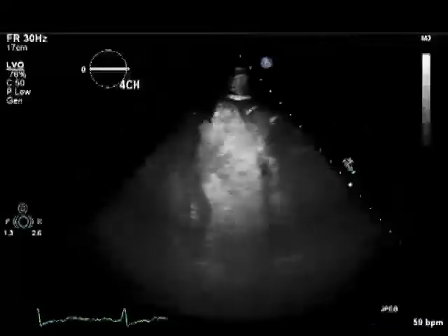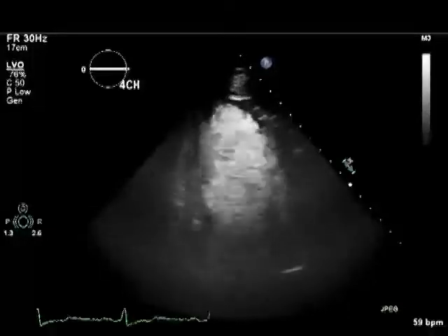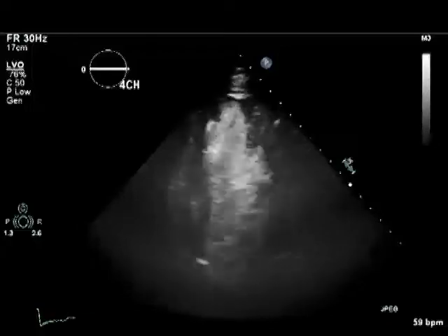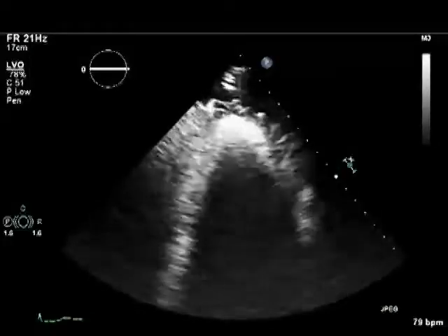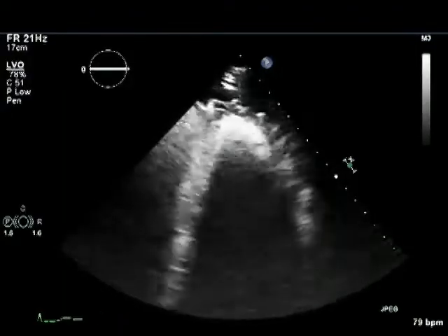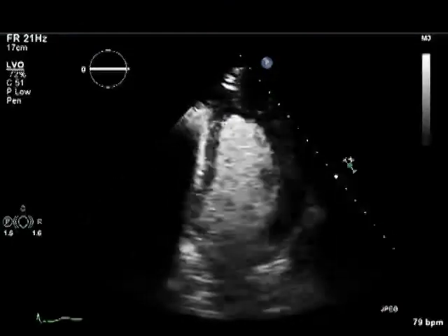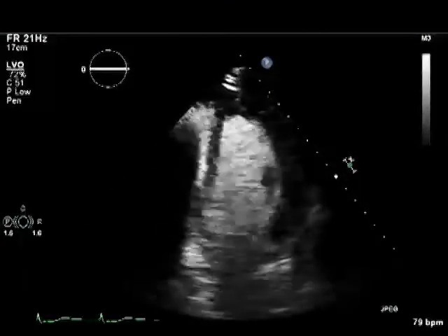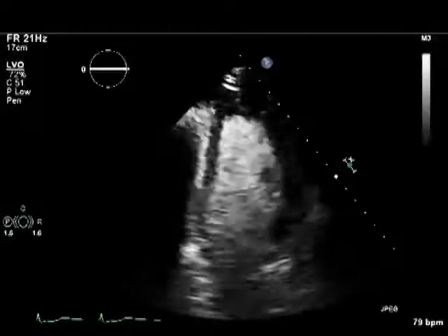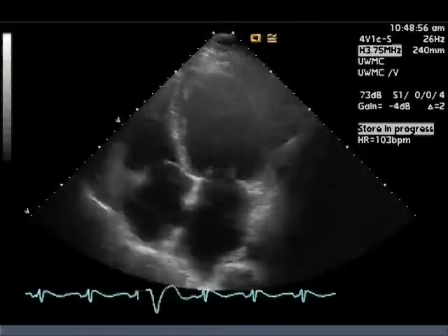The amount and rate of injection should completely opacify the left ventricle, without swirling of contrast, as shown in this example, with contrast injected too slowly or at too low a dose. When contrast is injected too quickly or at too high a dose, dense contrast in the apex shadows the rest of the ventricle. This effect usually clears in a few beats, allowing recording of contrast images that show the entire LV. Contrast also can be helpful in diagnosis of apical left ventricular thrombus.